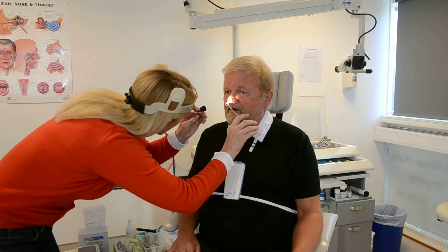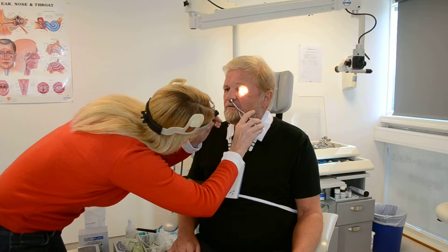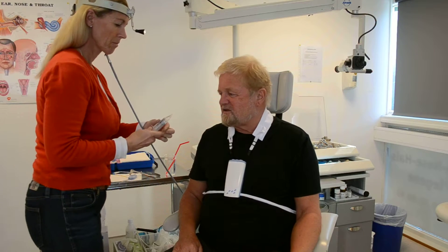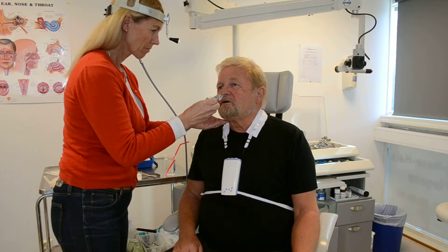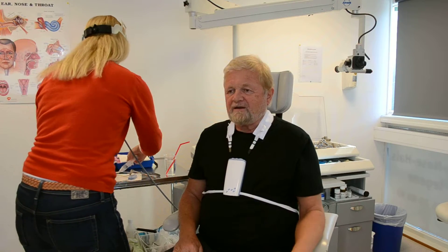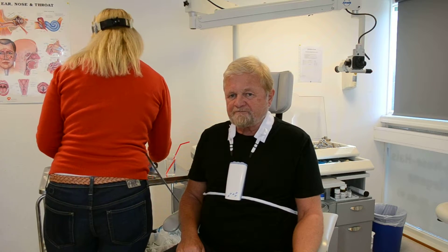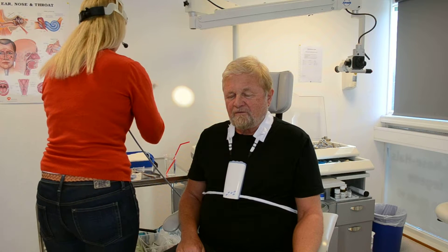Then you put in some local anesthesia — only a few cc's — and let it stay there for about five to ten minutes before you proceed.